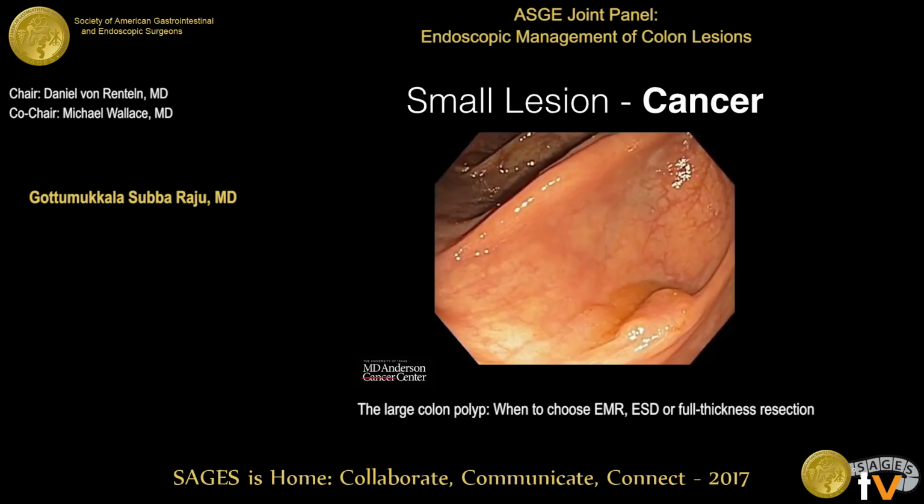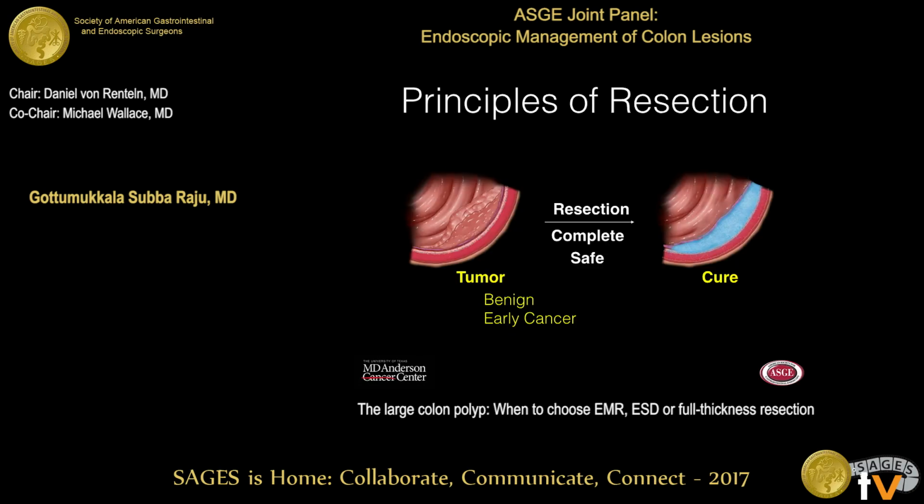And this is a smaller lesion. Again, as you can see, there's a flat area. And that came back as cancer. Something to keep in mind before endoscopists go for resection.